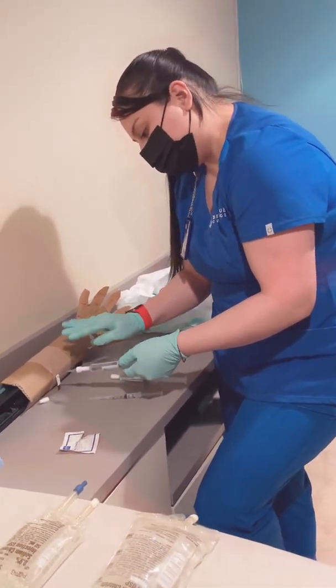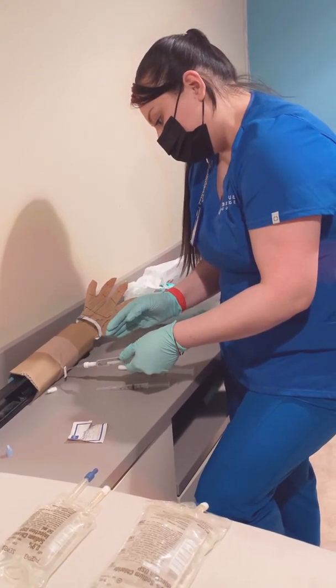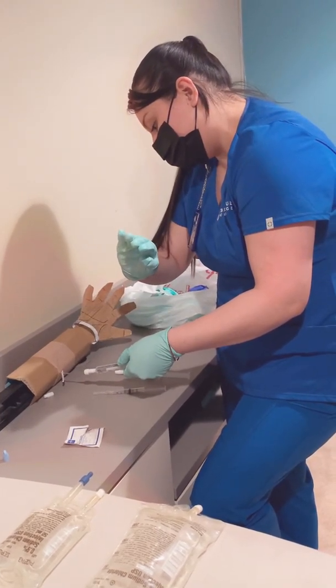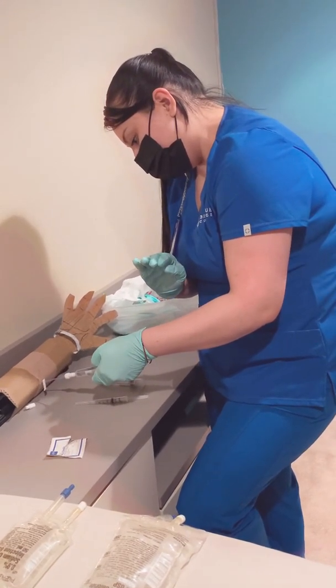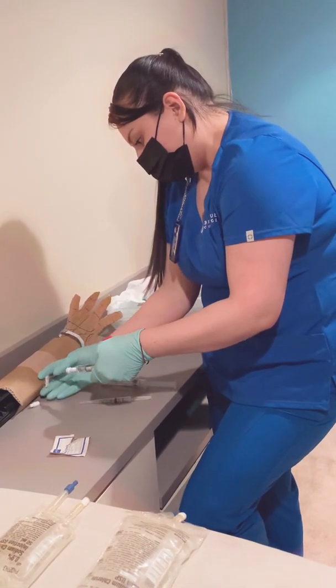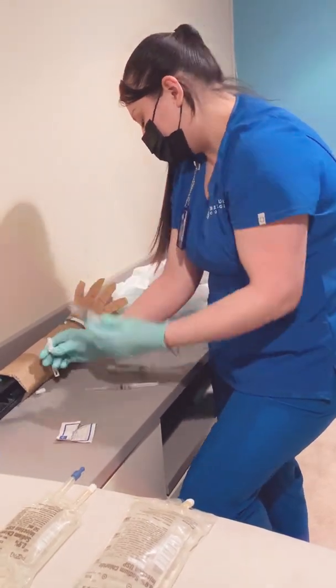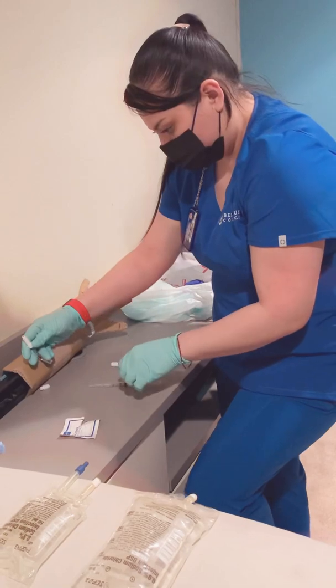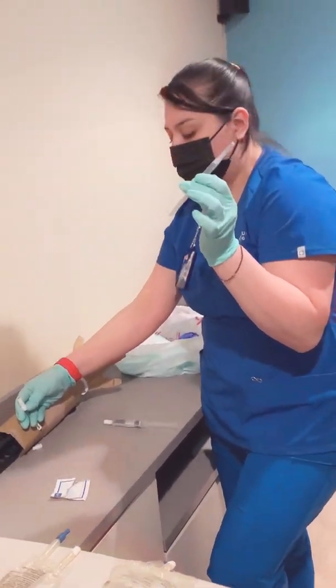And now I'm going to dispense the 3 to 5 ml into the IV line. Okay, I'm going to clamp it. Remove the syringe.